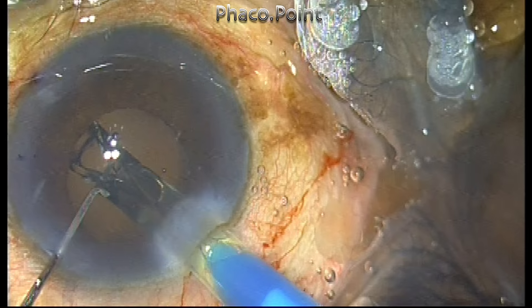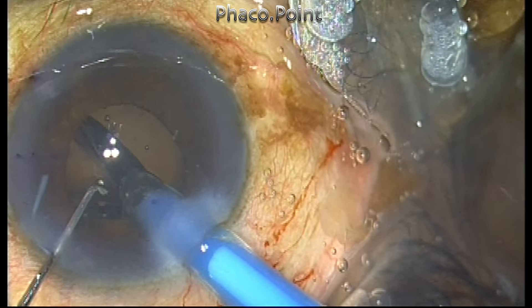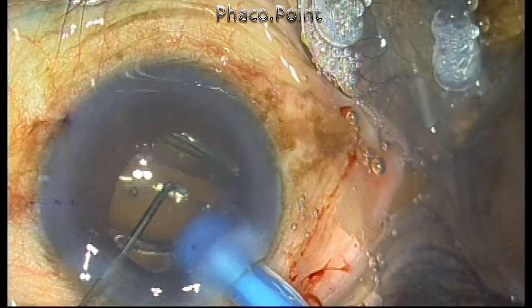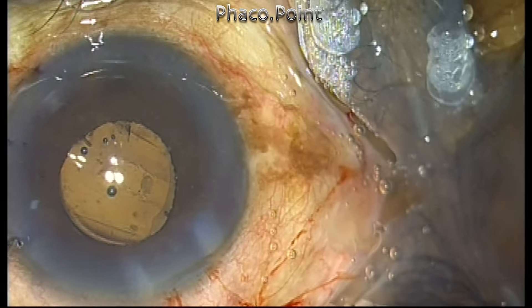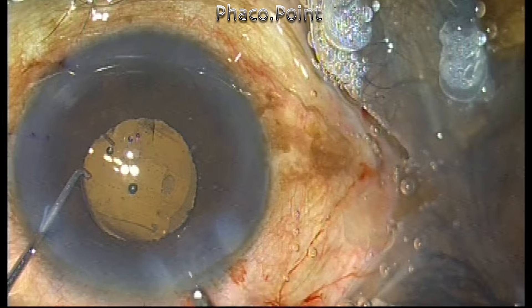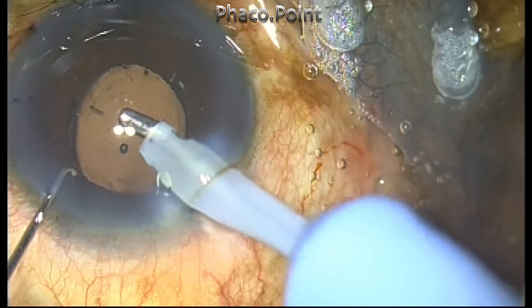I'm injecting the lens into the capsular bag. During injection I noticed that there was a lot of force required to inject this intraocular lens — a subtle sign which I chose to ignore at that point. Once the IOL was injected into the eye, I decided to wash off the viscoelastic and get the IOL to align in the correct plane by pivot rotating it.